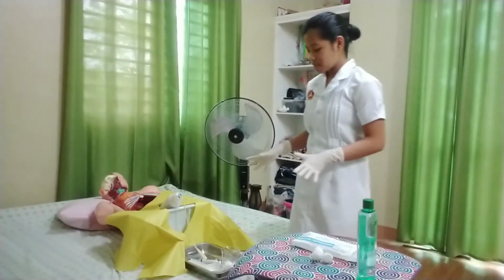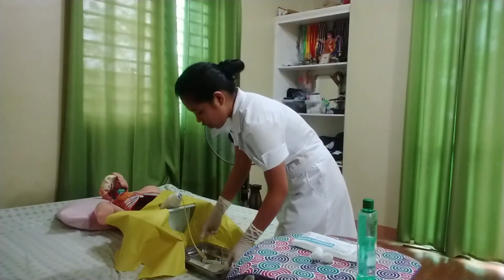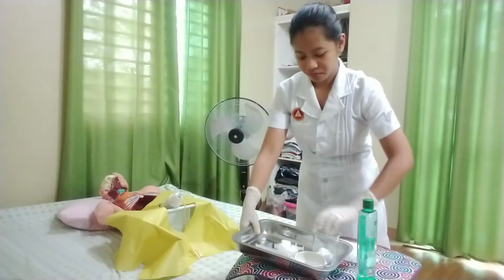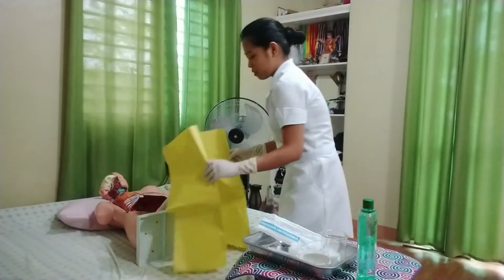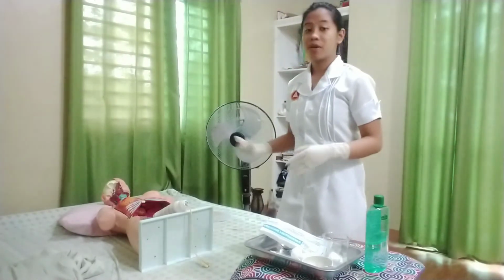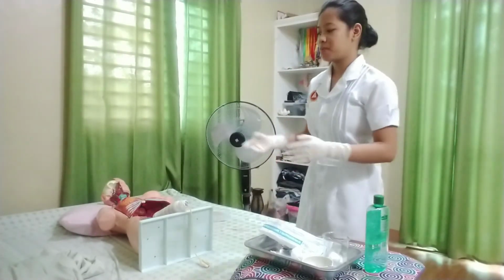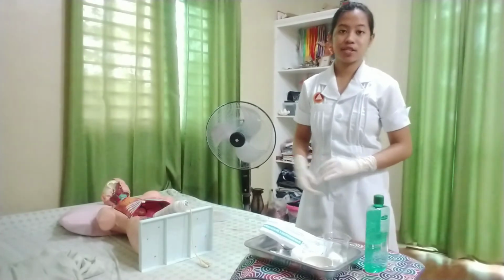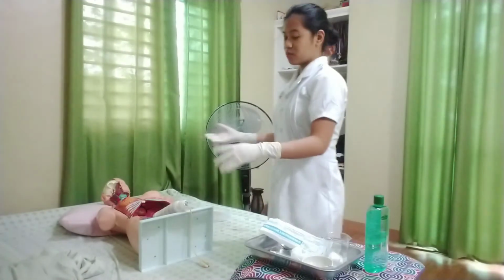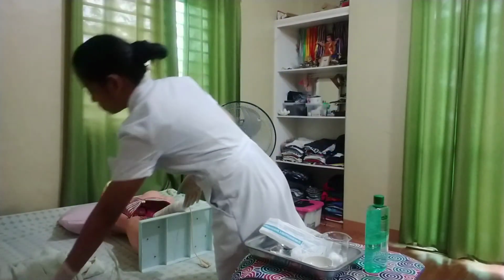After that, we will remove all the equipment we used. Once we have removed all the equipment, we will make sure that the client is clean and dry, and the bed as well, and we will make the patient comfortable.